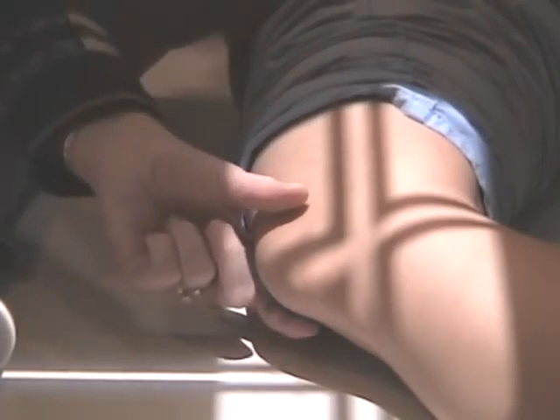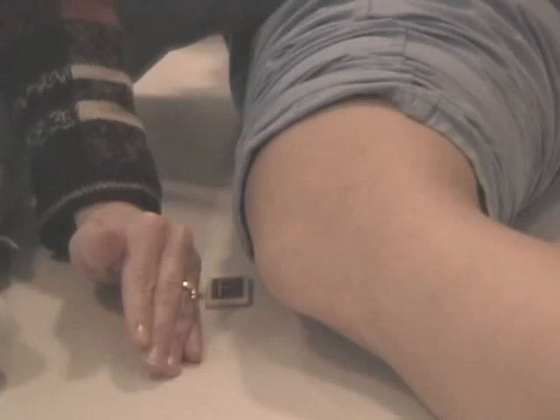The radiograph will give you evidence. It'll show you the knee joint at the center of the film. It will show the patella as being away from the femoral condyles. Away from the femoral condyles. Okay.